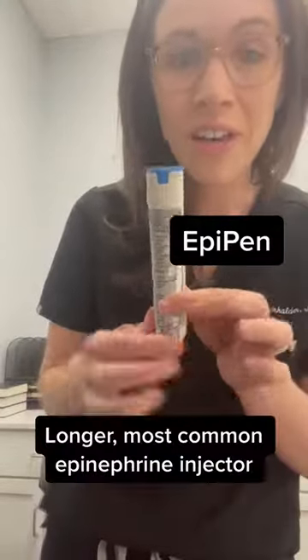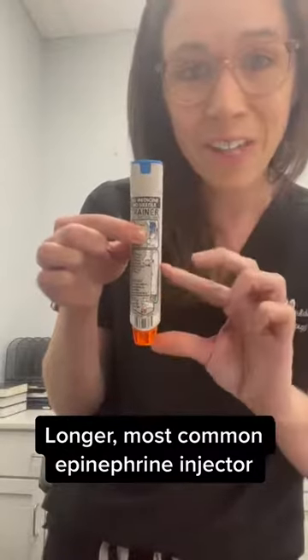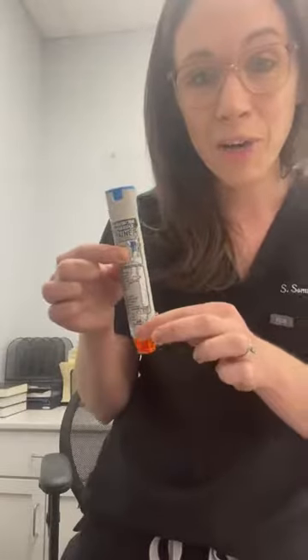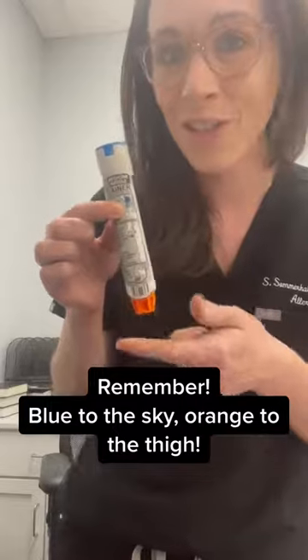Those same instructions will apply to the generic auto-injector. The only difference is that it's longer — though the needle is only about this big. You inject it in the same spot. A good way to remember how to inject it is: blue to the sky and orange in the thigh.